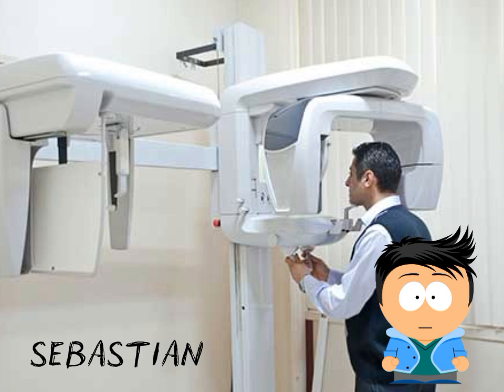The panoramic dental X-ray equipment is a diagnostic device, an orthopantomograph, that is used to capture a 2D image of the jaws, teeth, TMJ, and sinuses. It is essential for evaluating dental pathologies.